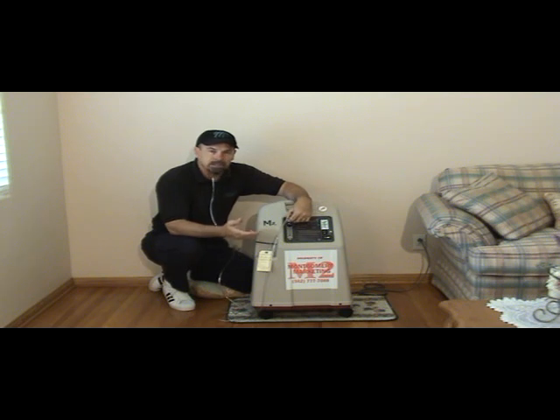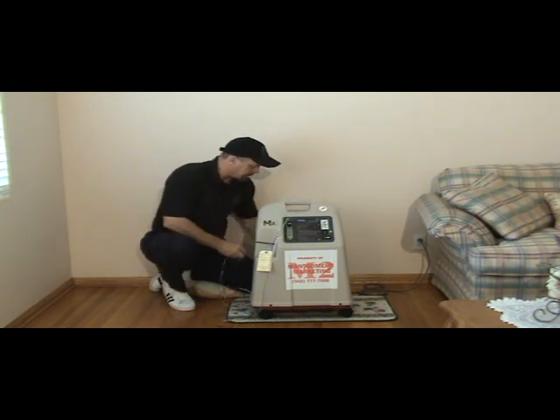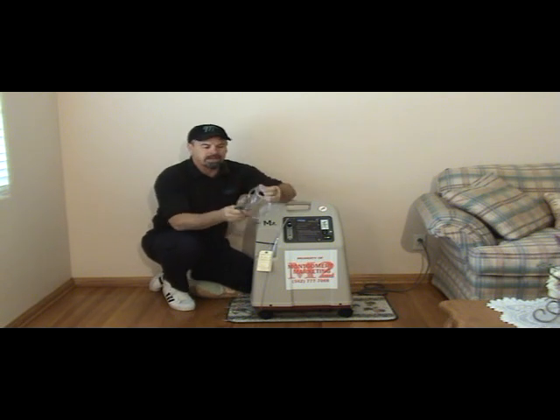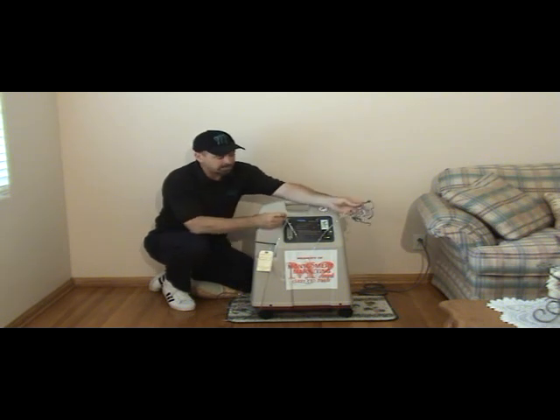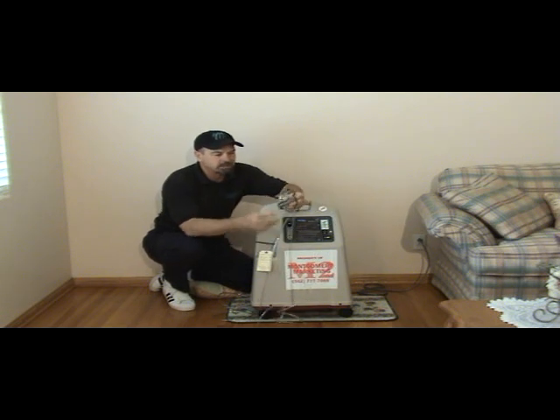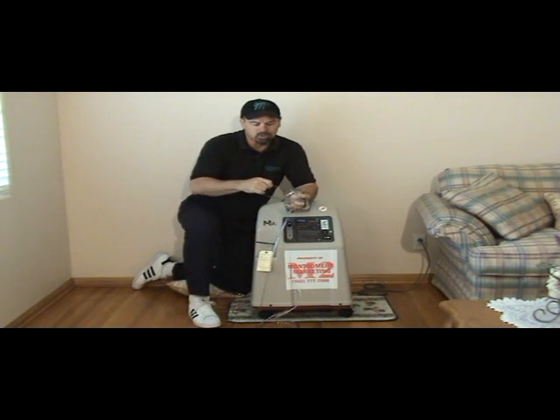An oxygen nasal cannula like this is always provided from 1 to 4 liters. When you get above 4 liters, there are other options. One of the options is a mask, an oxygen mask. The oxygen mask also has 2 ends. One is the same as the end that hooks into the concentrator, so you would hook that on the concentrator the same way. Then the mask itself has some pull straps on it.